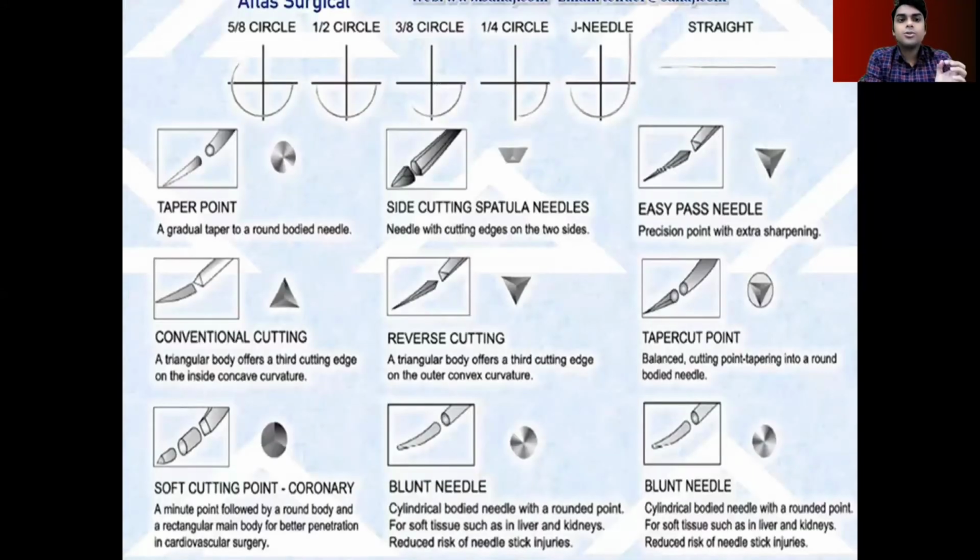In this image, you can see the 5/8 circle, the half circle, 3/8 circle, 1/4 circle, and J needle, as well as the straight needle. These different types of needles have uses in different spheres of surgery.